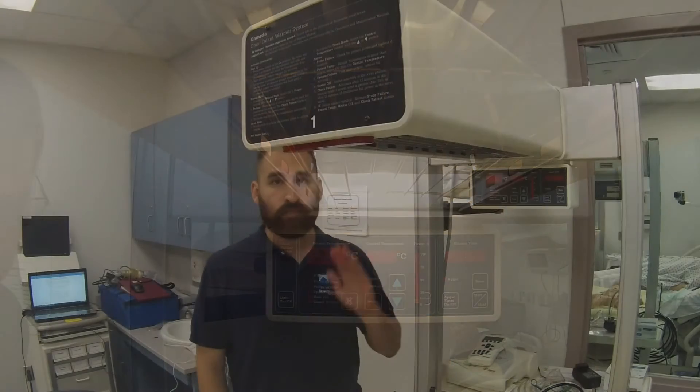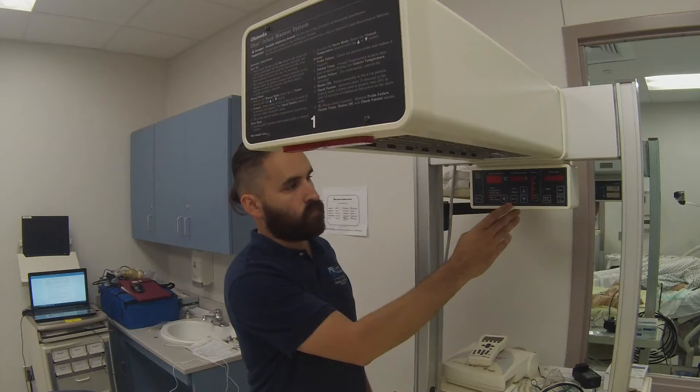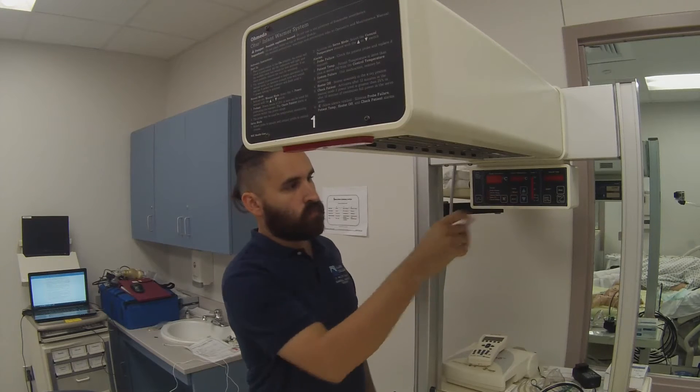My name is Nicholas Castro, and I'm with the Alamo College's Biomedical Engineering Project. All models of the Ohio infant warmer system provide a controlled source of radiant heat for infants and pediatric patients. The control system uses a microprocessor and provides both manual and servo modes of operation. The model 3300 has an integrated bed for infants and is intended for procedures and long-term care in the nursery and L&D.